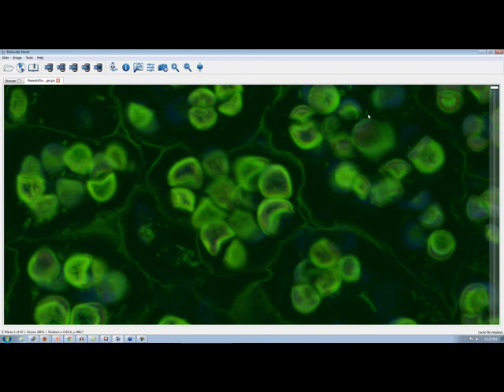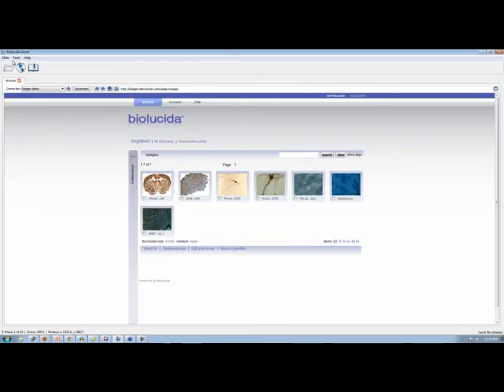So if I start with the hippocampus, the most lateral aspect of the hippocampus on image 1, and I move to the right, I want to move to the right on all my images. And now I saw you do something like that previously. Can you show us how that gets done? Yeah, exactly. So let me close down those images.